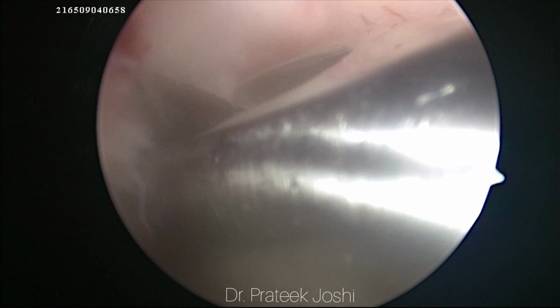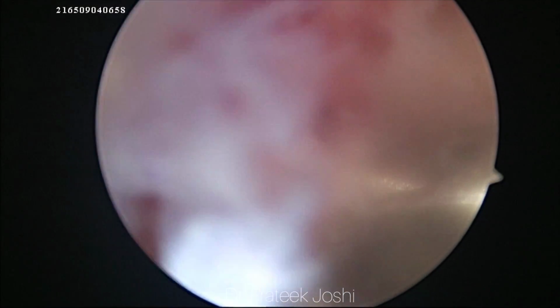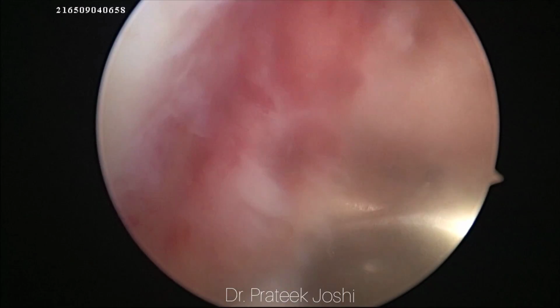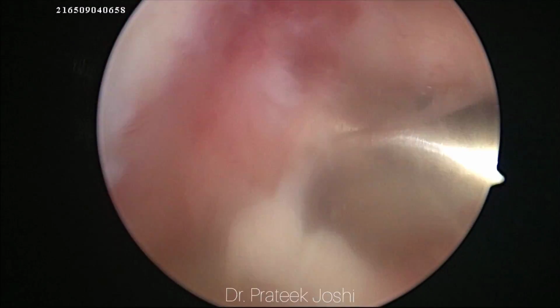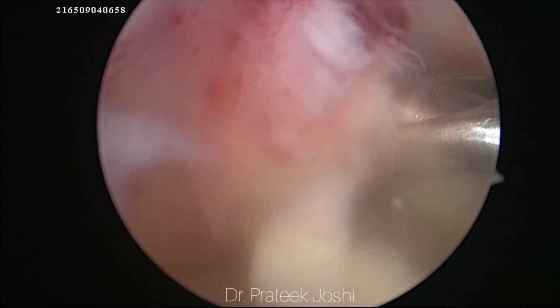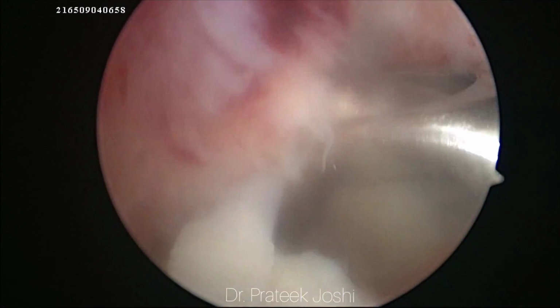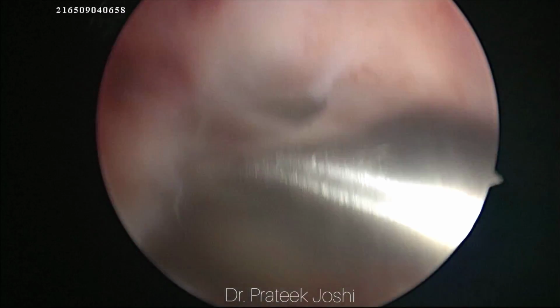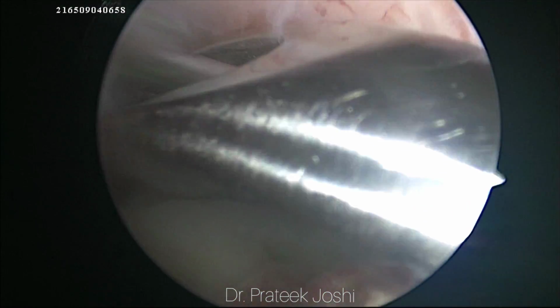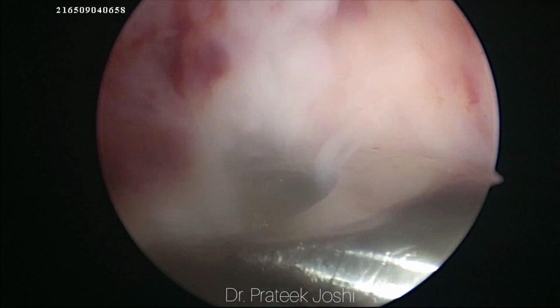We have introduced our arthroscope through the anterolateral portal, and I have inserted the femoral guide through the anteromedial portal. I am drilling the guide wire through the femoral guide while keeping the knee in a hyperflexed position, and you are seeing that I am drilling the guide wire through the lateral femoral condyle in the native ACL footprint. Here we are drilling the guide wire in the lateral femoral condyle via the accessory medial portal, which is going to help us in creating anatomical oblique ACL tunnels.